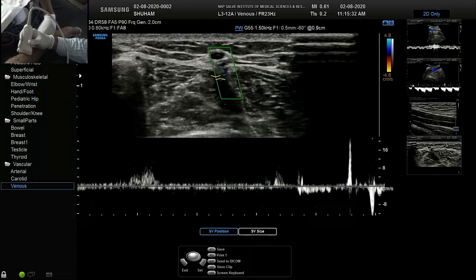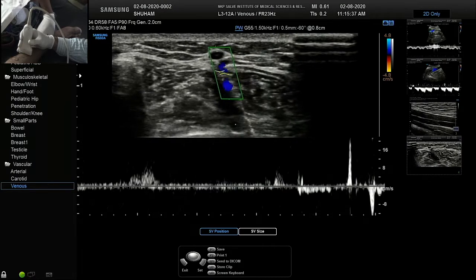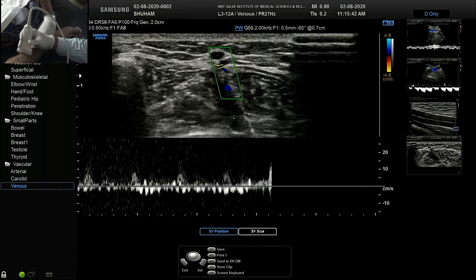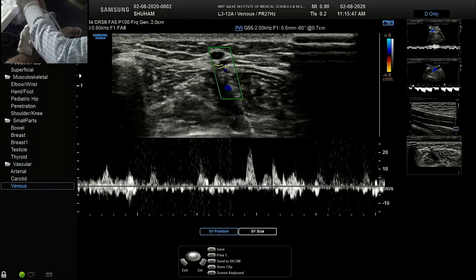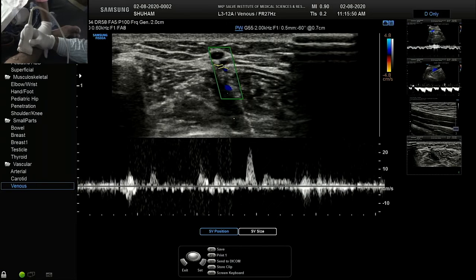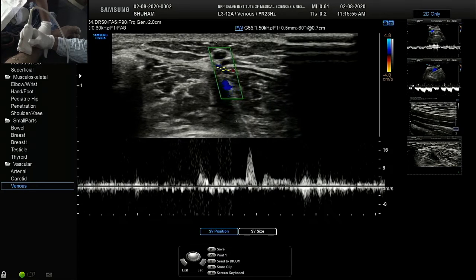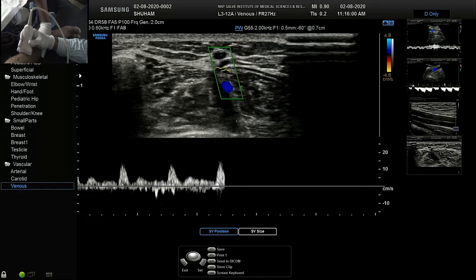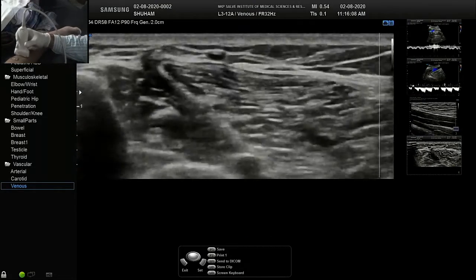See that entry point again. Try to see what is happening there. Compress. Squeeze it 1 second and relax. Wait. This compression has to be a little bit sustained so that everything is emptied out, and then you see what is happening. Compress. Now we will demonstrate in some other perforator which is a little bit bigger in size.